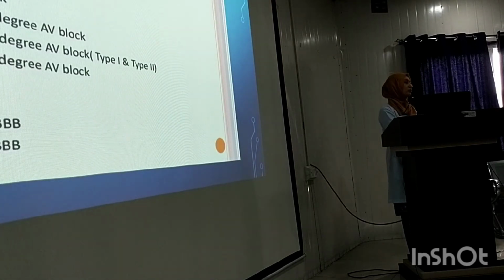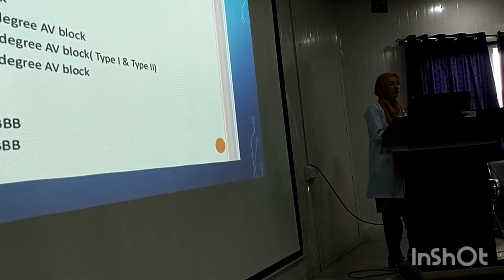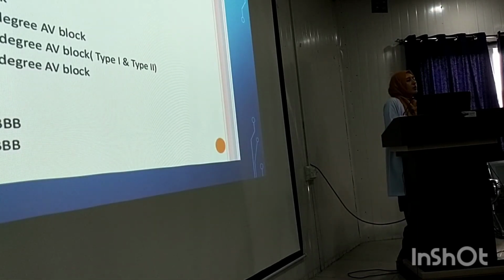So now we are going to talk about heart blocks. Should I talk about heart blocks? Okay, a little bit I am going to talk about the heart blocks. Whenever we talk about heart blocks, we are usually talking about the AV blocks, the atrioventricular blocks.